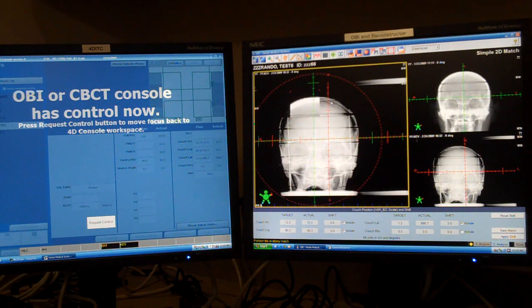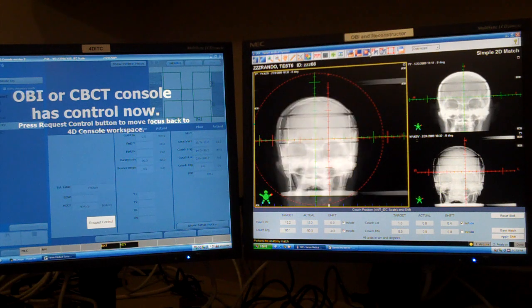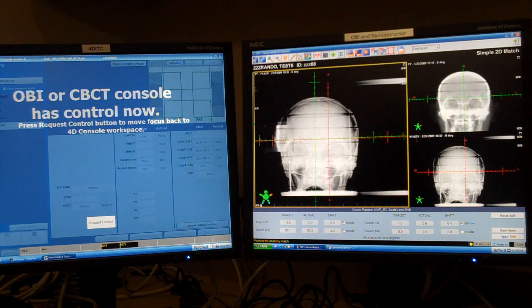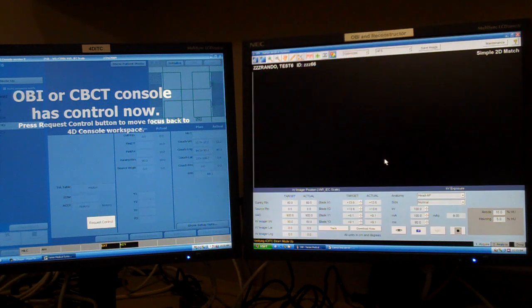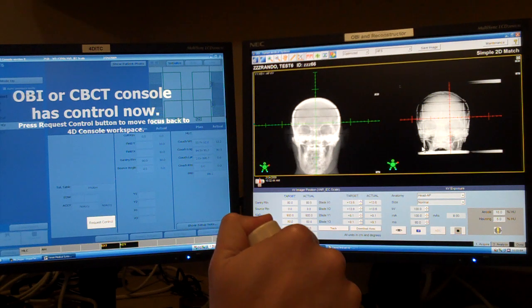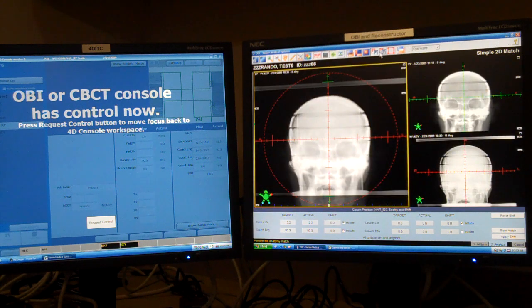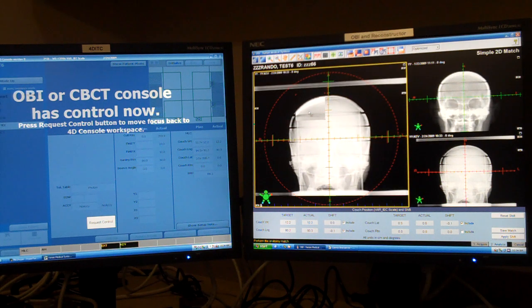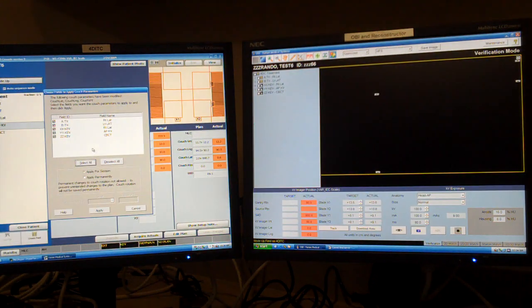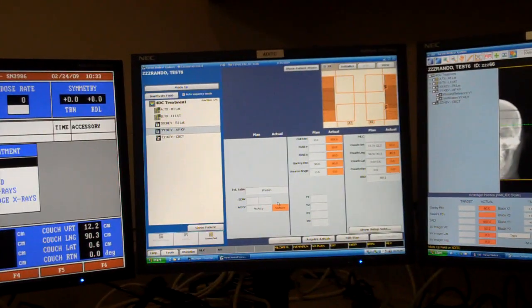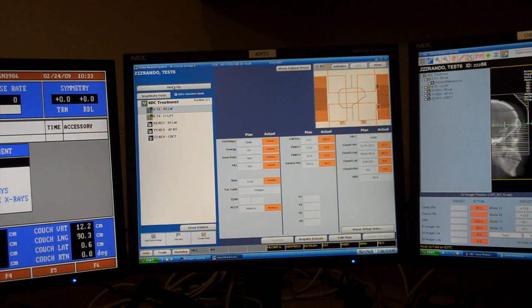I open up a spyglass to make sure that was approximately the correct shift. I accidentally moved the image a little bit, so I will not apply those couch shifts. I take another image, do an auto-match, and verify — again, one millimeter and one millimeter. I take a spyglass: orbits line up well, skull lines up well, so I feel I'm in a good position. I cancel and don't apply these couch shifts. Now I'm ready to mode up on a treatment field and treat. Stay tuned.